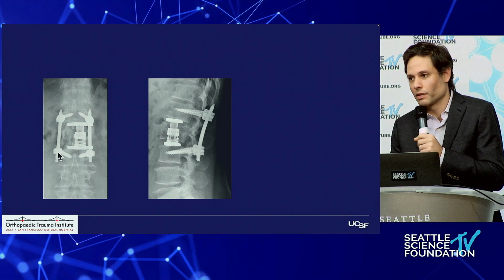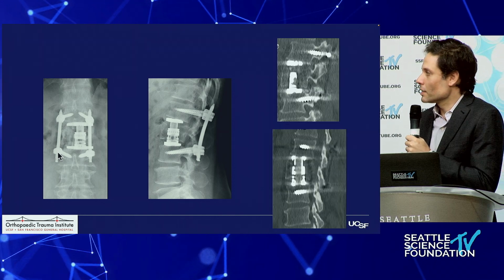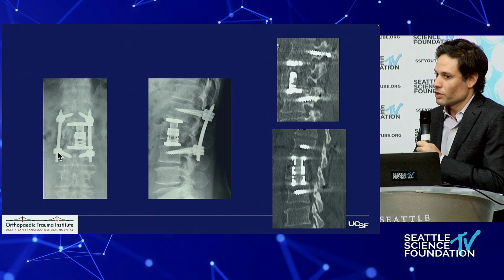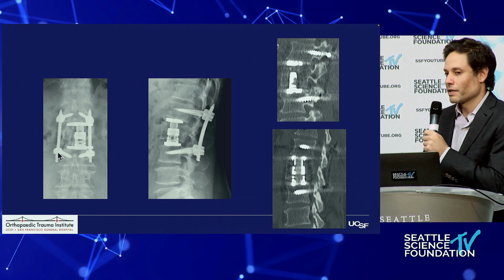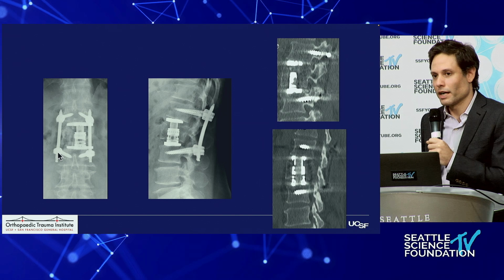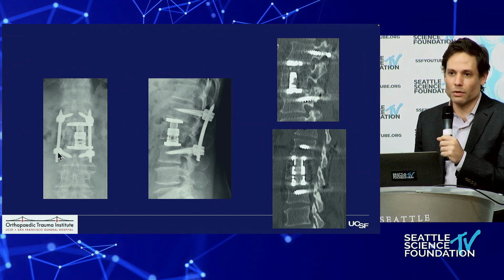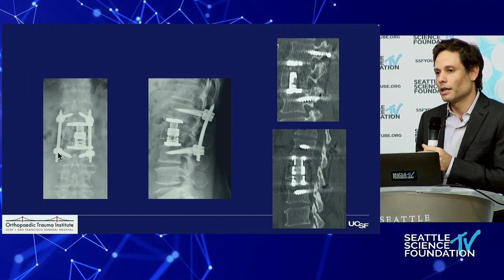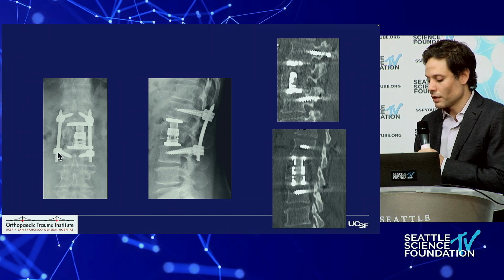Initially, when I started doing this, I was wondering, are these actually fusing, or am I just messing the joint up? And so with this patient, he had some residual pain at a year, and at the facet there, you could see that there's bridging bone. So I think, in terms of the MIS principles, we try to limit the number of levels. We try to do stuff percutaneously when it's appropriate. Clearly, if this was someone who had compression, he would need an open procedure, right? So I think you just need to do what's needed for the patient.